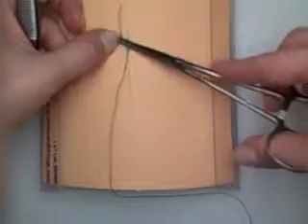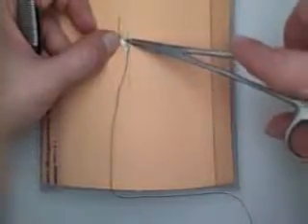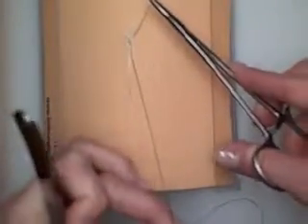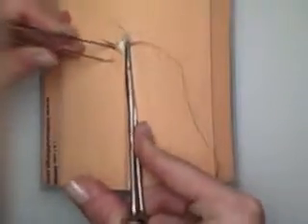I'm trying to prevent my stitch from getting locked here. You want both edges to be on the same side so that it doesn't get locked. We're going into the deep dermal layer, coming out right below the tip underneath the skin.